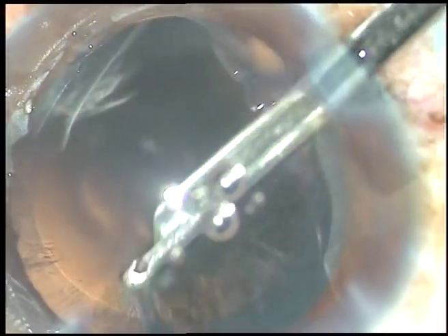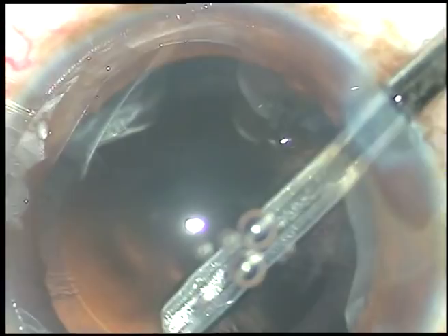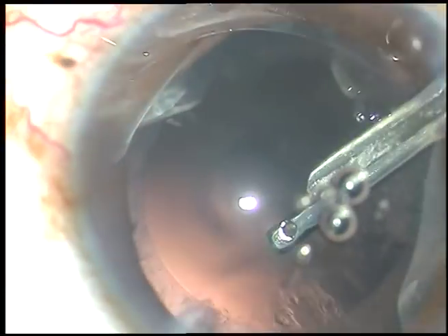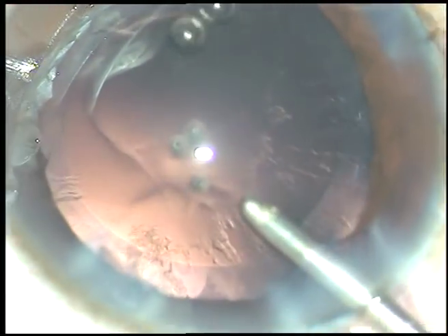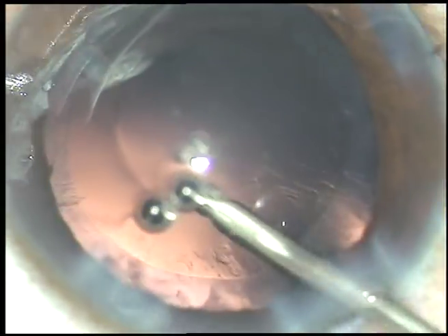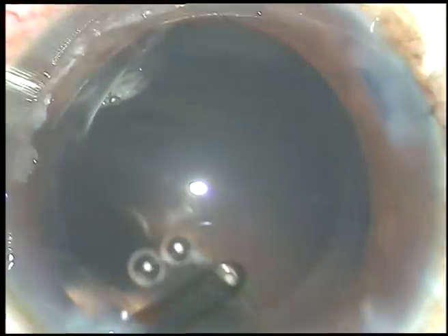Now, after cleaning the cortical matter, you see that there is some cortex or some lens fibers sticking to the posterior capsule. In this case, what I do is hydropolish. By hydropolish, I mean I use the irrigating jets of fluid from the irrigating probe of bimanual IA for polishing the posterior capsule. The capsule is not even touched — from a distance, the fluid jet is directed over the posterior capsule. The cells just in front of the main incision are getting dislodged now. That's it — polishing is done.